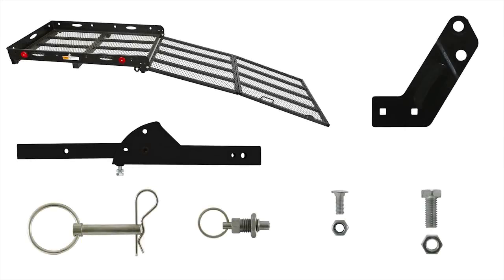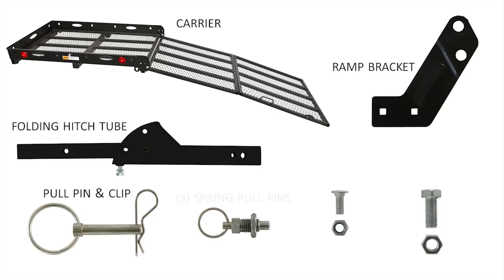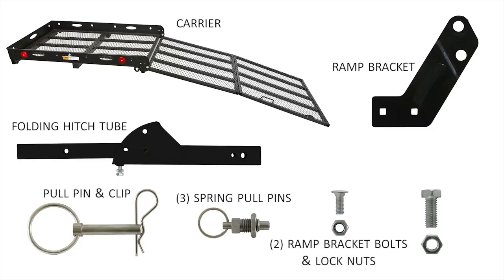Parts needed for assembly include carrier, folding hitch tube, ramp bracket, pull pin and clip, spring pull pins, ramp bracket bolts and lock nuts, carrier bolts and jam nuts.